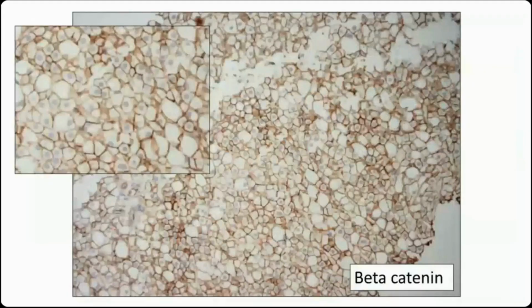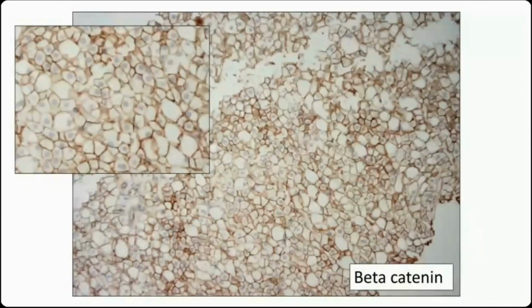And here is the liver fatty acid binding protein, showing that area of normal liver that we saw before, and then negative. And well done, Sarah, with the HNF1 alpha inactivated adenoma. Importantly, beta-catenin, with all adenomas, you have to be careful. With beta-catenin, normal livers stain membranous.